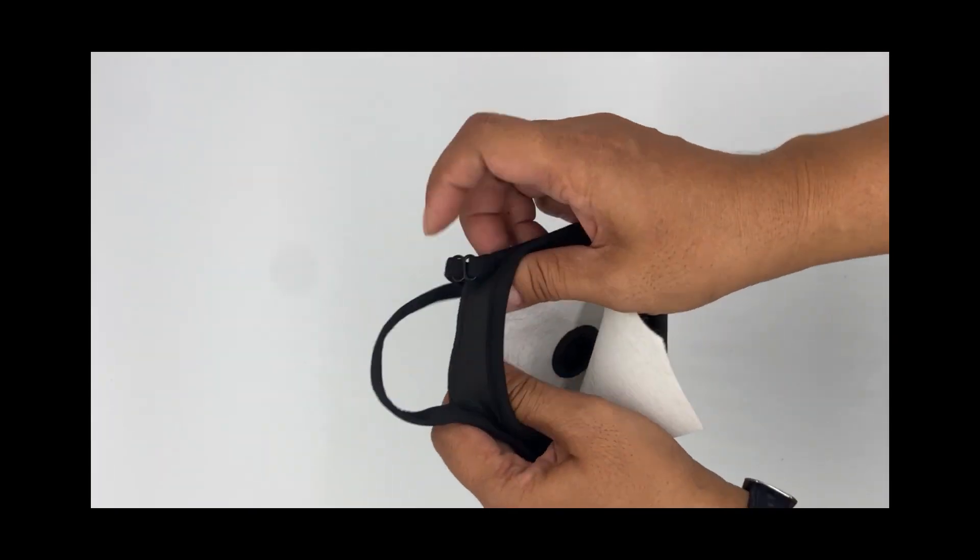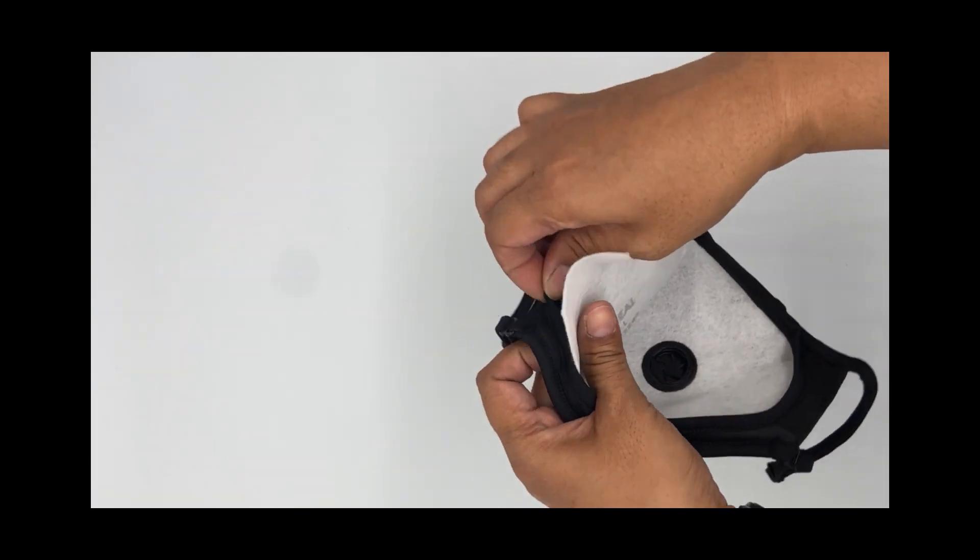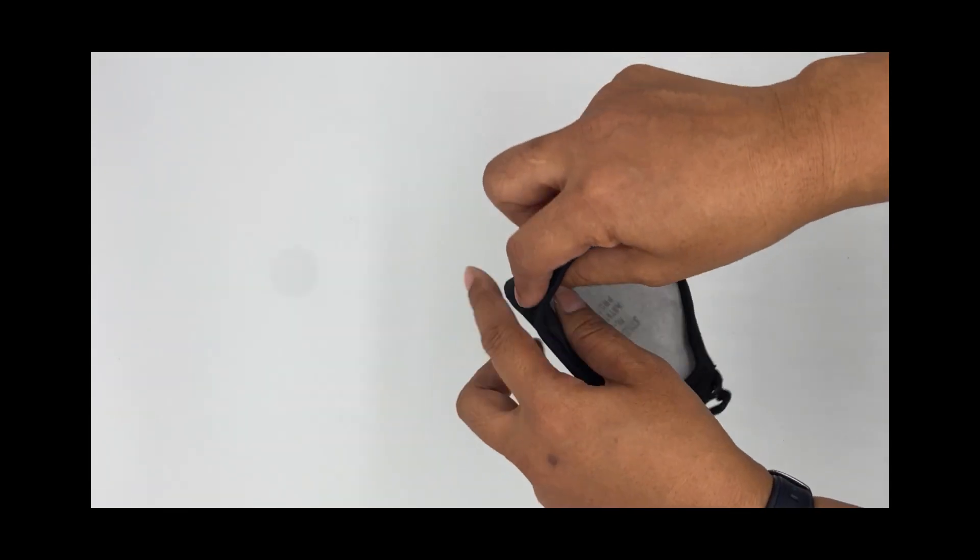The valve and snap ring help hold the filter in place while you tuck the filter inside the soft foam liner.